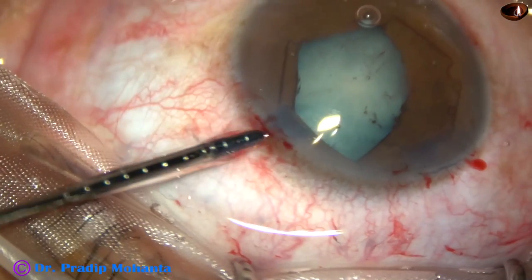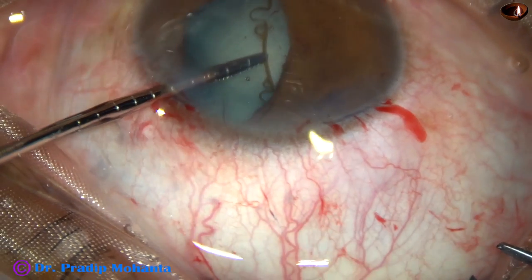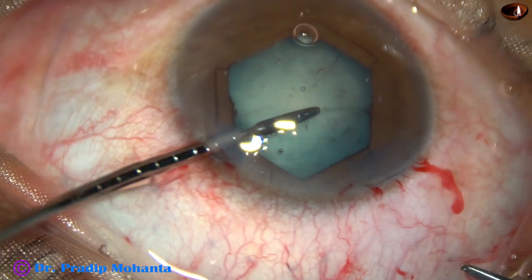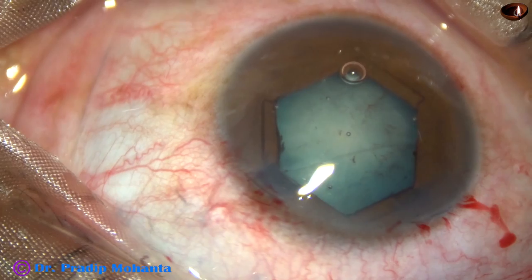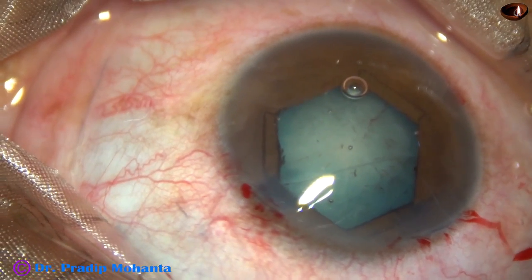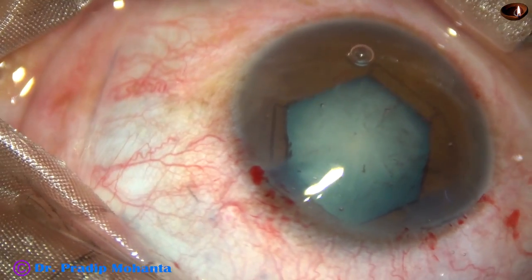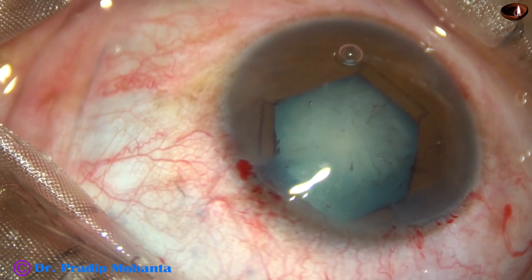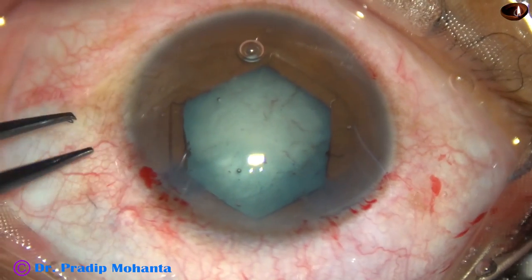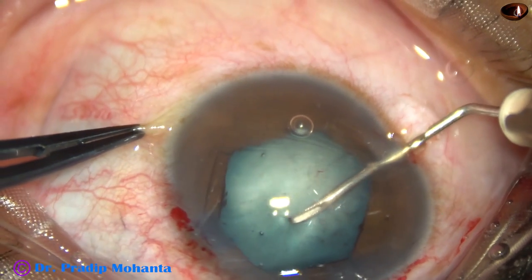Now I hold the flange centered at 5 o'clock and tuck the alternate flanges. I go through the left side port, use my non-dominant left hand and tuck the flange there. This is a totally unedited portion of the surgery — it takes this much time for application of the B-hex pupil expansion device. The pupil has dilated to about 5.5 millimeters and we can do a rhexis of about 5 millimeters.